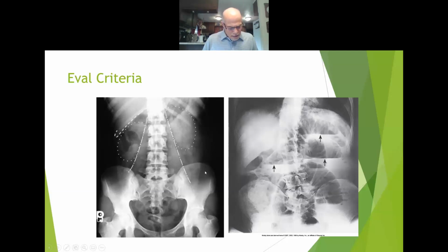Spinous processes in the center, ischial spines of the pelvis symmetrical. Your ilium is going to be, again, that little crest line right there. You see it? That's what they're after right there. We have equidistance. The ala and wings of the ilia are symmetrical. These are your alas or wings of the pelvis. They should be symmetrical in size. So that was your AP projection, supine or upright.